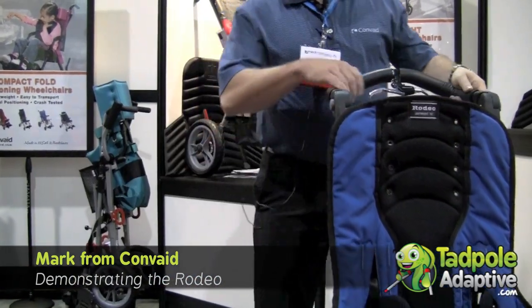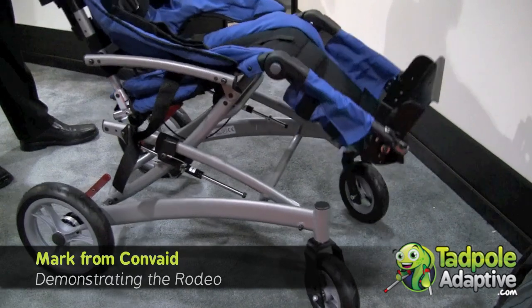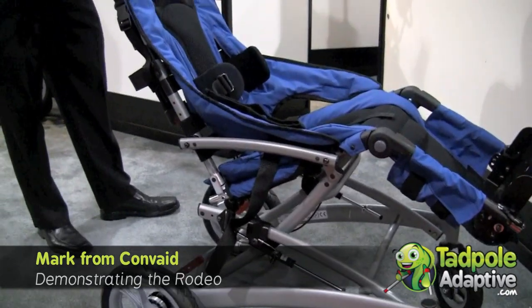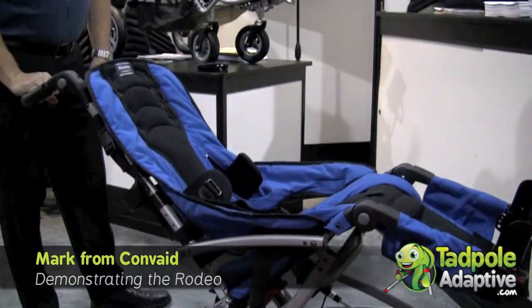The Rodeo is a tilt-in-space wheelchair. It tilts from 5 to 45 degrees, very easily with the grip of one brake release — kind of like a brake handle, but it's a release lever or a tilt lever. Very easy to function.